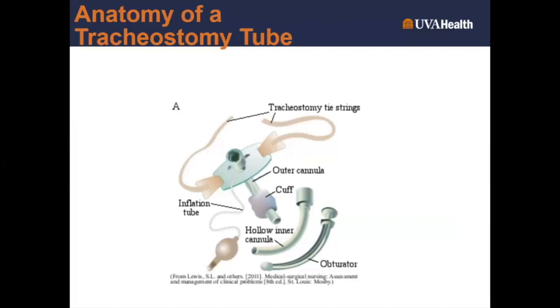These patients often have a really strong cough reflex. So I suggest keeping your hands on that flange and using the other hand to actually change out the ties. Doing that and taking your time doing that.